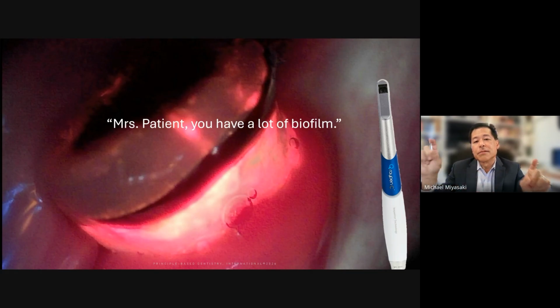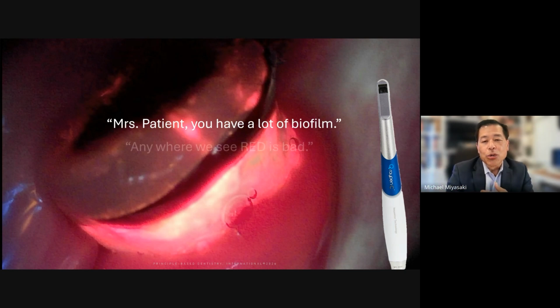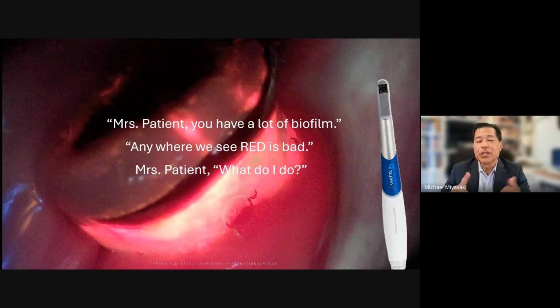So Mrs. Patient looks at this and they see the red glow, and we tell them, if you see red, red is bad. So we go through the same kind of explanation. Anywhere we see the red is bad. And then before we even get to you need to brush and floss, Mrs. Patient is asking you, what do I do?